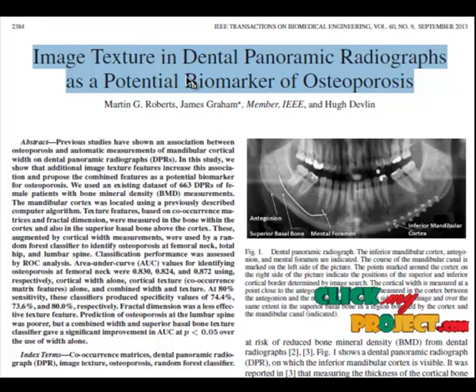Gabor filters are similar to those of the human visual system, and they have been found to be particularly appropriate for shape representation and discrimination. The support vector machine, SVM, is a universal constructive learning procedure based on the statistical learning theory. It is used as a classifier in our system to classify different ages, so we use a multi-SVM technique.